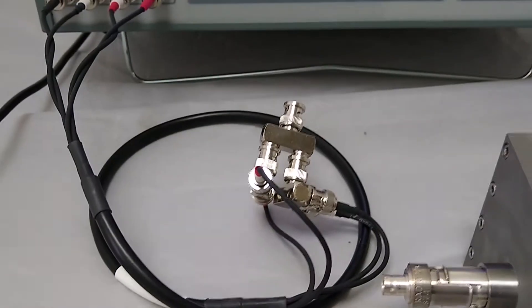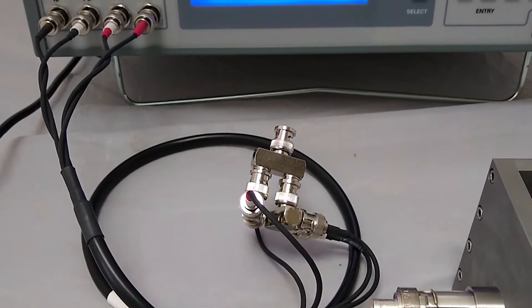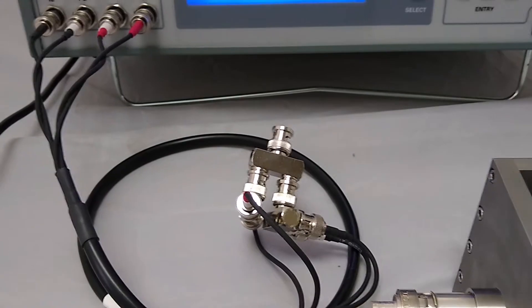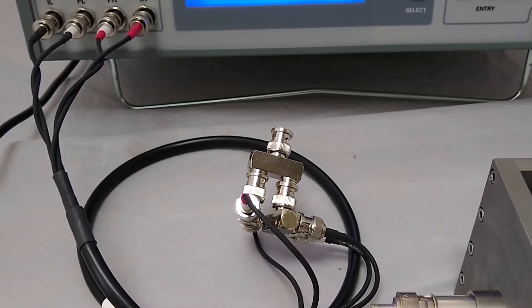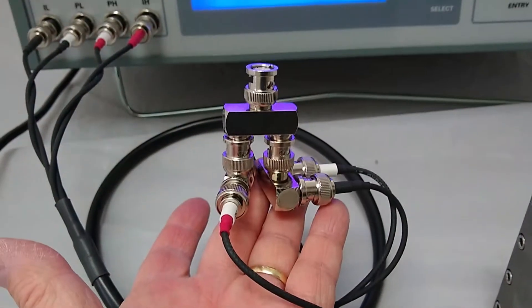Performing a short is not particularly important mainly because we're measuring low capacitance. So it's pretty much dominated by open. So in this particular case, I just removed the 874 and the BNC to banana adapters and just connected the two T's using another T. This allows them to be basically all connected for a short. Once we've done that, we can go over to the 7600 Plus.